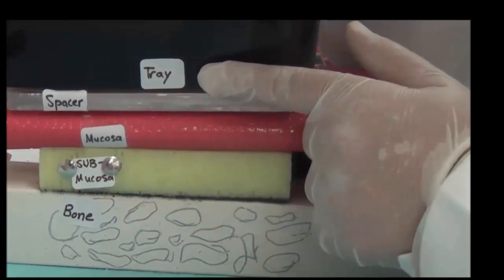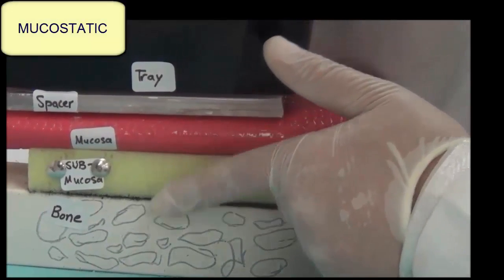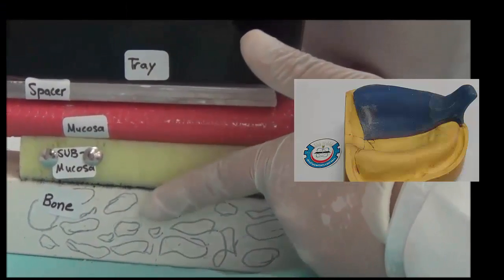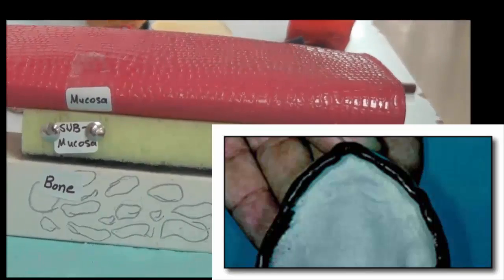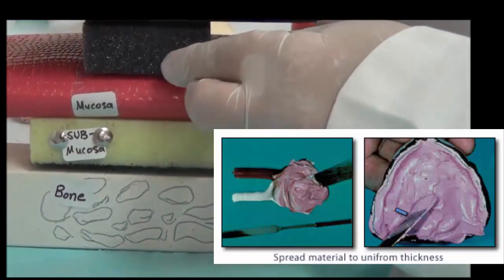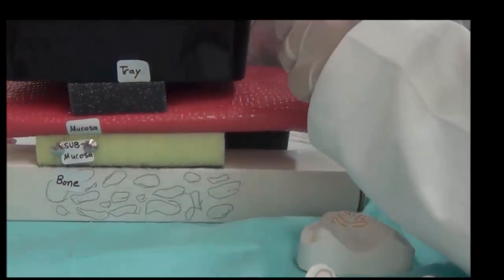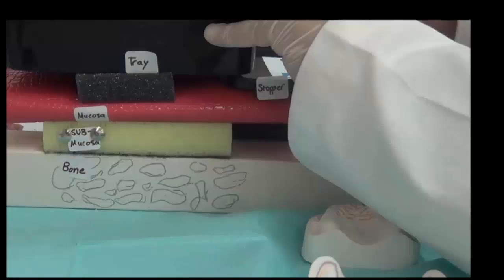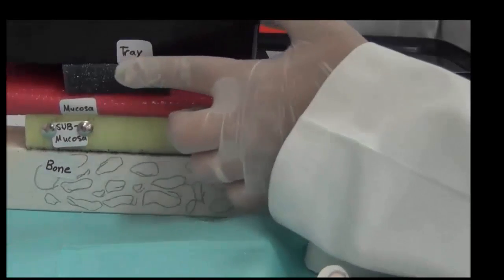What happens in the case of the presence of the spacer? So this is a tray with a wax spacer in, and the mucosa, submucosa, and bone. We take our border molding, see that the tissue is not compressed, and once we're ready to put in our impression, we remove the spacer and the tray, put impression material in the tray, and begin squeezing. With the spacer preserving the space for impression material, we could not squeeze a lot, because we also have stoppers maintaining the space. So no matter how much I squeeze, the impression material stays not in a totally compressed status.